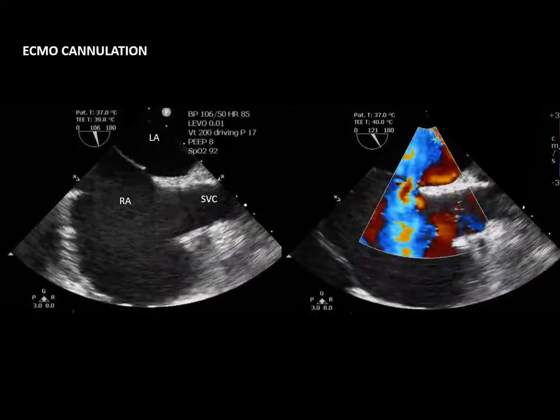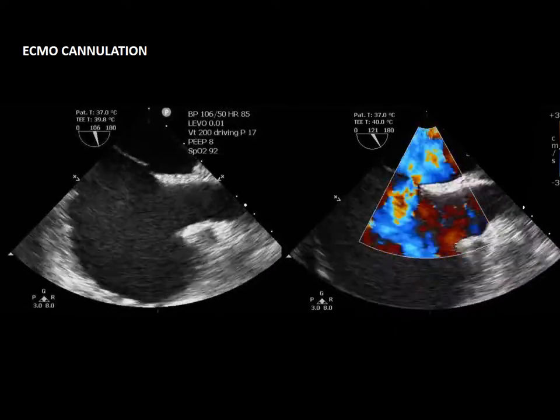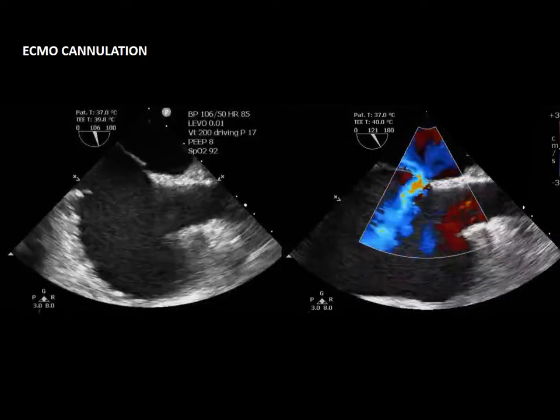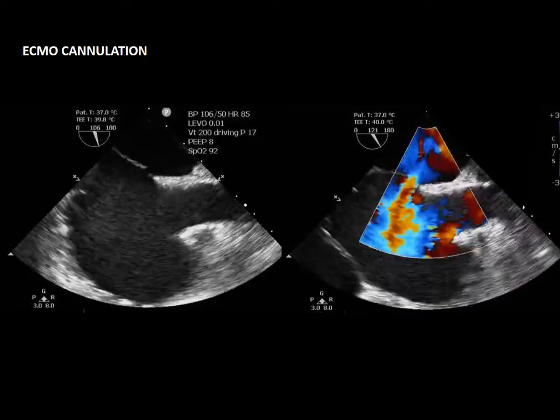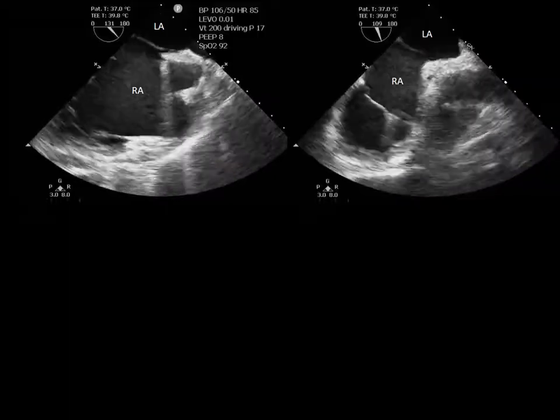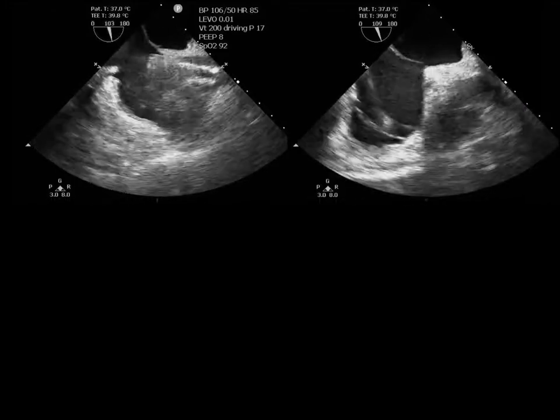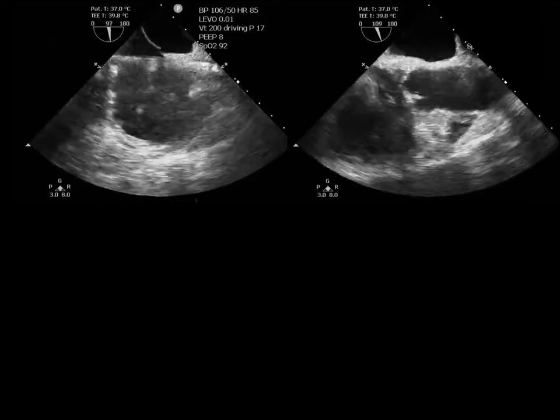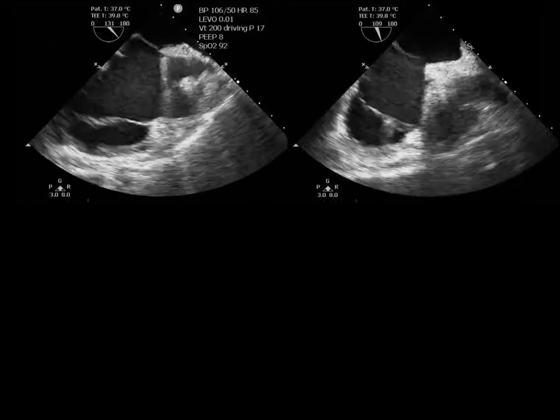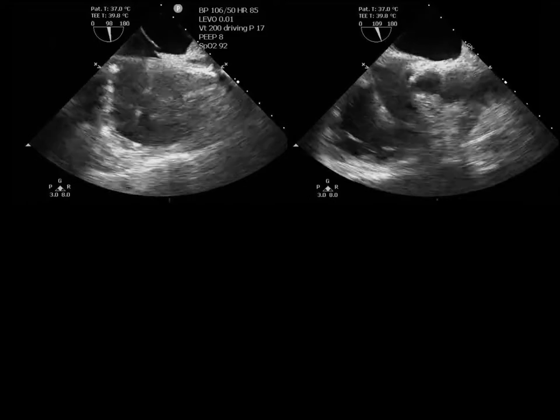This was an example of a patient who had COVID ARDS, who was diagnosed with an ASD at the time of the cannulation. As you can see, it's left to right, so that was not necessarily significant in terms of worsening oxygenation. But initially you could see that both wires were in the right position from both vena cava, but then during iterative dilations, you can see that the wire was bending in the right atrium and eventually flipped out of the superior vena cava.